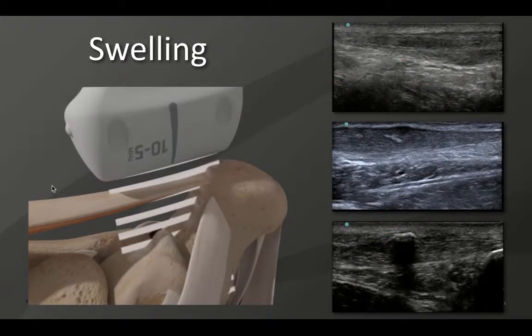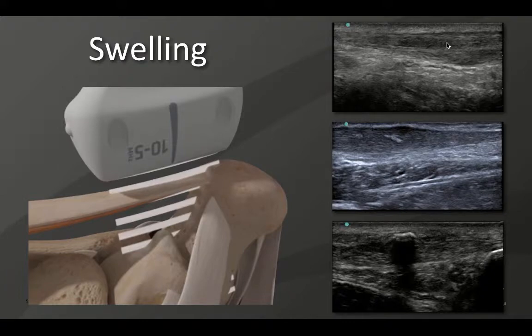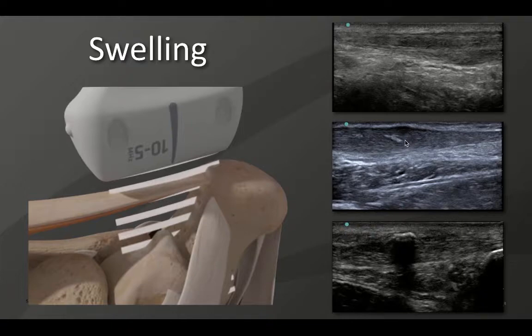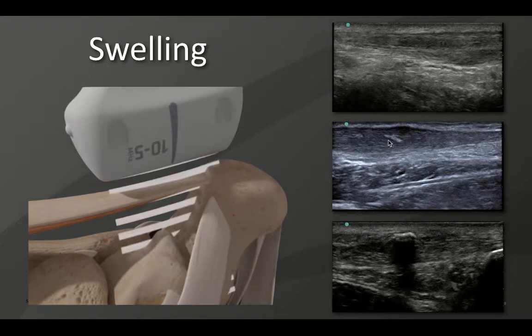Other forms of swelling: if you run your finger across the tendon body and feel focal swelling, you might wonder what stage of pathology you're dealing with. This is intrasubstance longitudinal tearing, where you can see disruptions of the Achilles, but the fibers are not retracting away from each other — they are separating in their longitudinal axis. Going to the middle image, what would likely happen if left unaddressed is scarring — a disorganized collagen that has filled in an old tendon defect. You can throw color on to see if there's any hyperemia. The tendon architecture shows a belly of swelling, and as we climb toward the gastroc area, we see focal swelling with what will probably become a calcium deposit if left unaddressed.